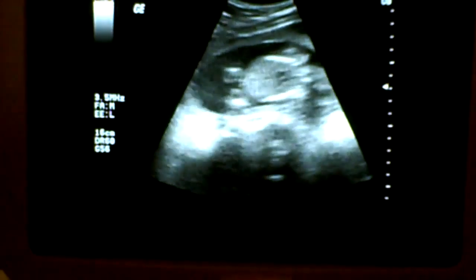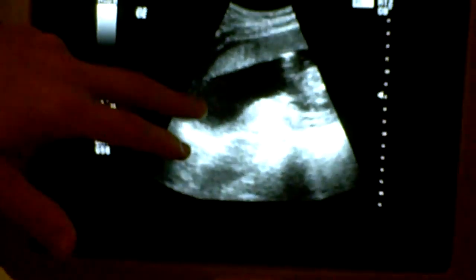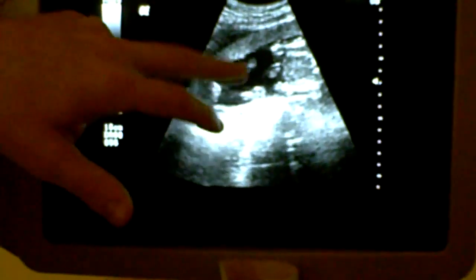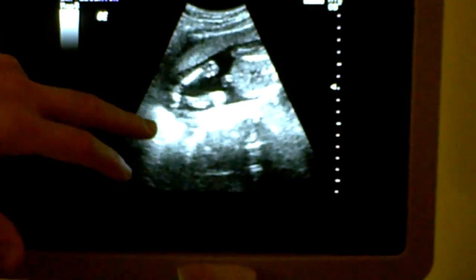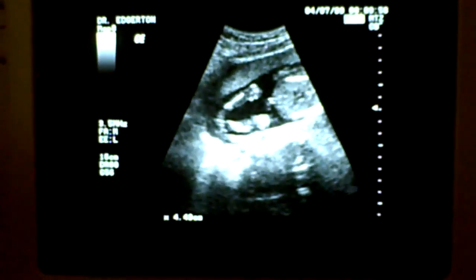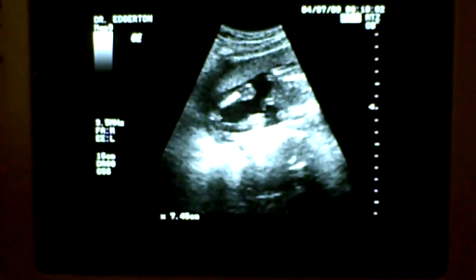As we move down, see the legs — let's see legs and feet. See the knees and feet. Is that the umbilical cord right there? Yeah, right here in the middle — umbilical cord, knee there, knee there, feet, feet there.